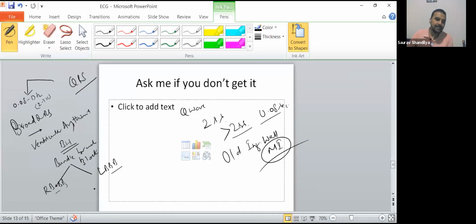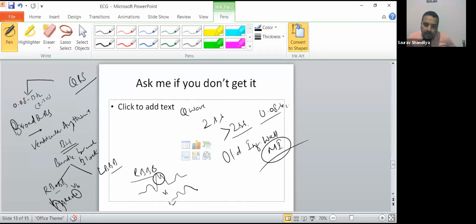Okay, how will you understand? I am giving you mnemonics. If it is a right bundle branch block, M, remember MARROW. Why you have to remember MARROW, I'll tell you. Okay, V1 and V6. See your ECG on V1 and V6 in case of right bundle branch block. What will happen? It will go like this: P wave, then Q wave, then R wave like this, ST wave, finish. Okay, M at V1. So if you see your V1 lead, it will be M like this. And the same thing if you see your V6 lead, P wave, okay, it will go down, W like this. So this is how MARROW, right bundle branch block.